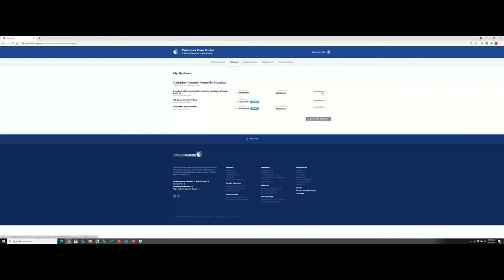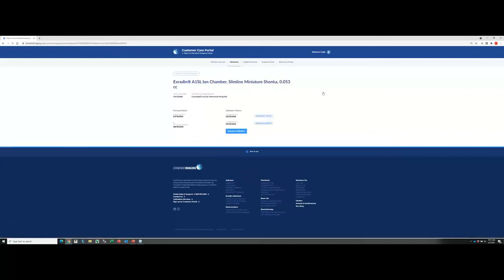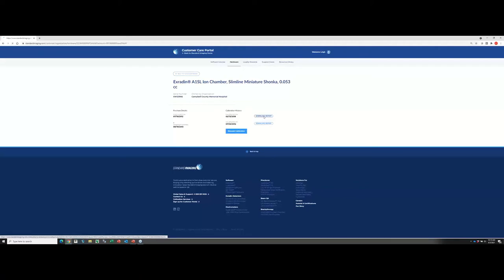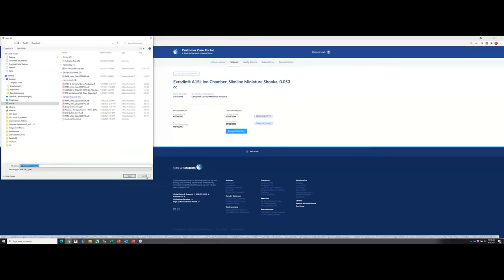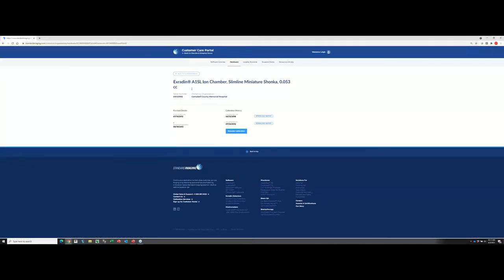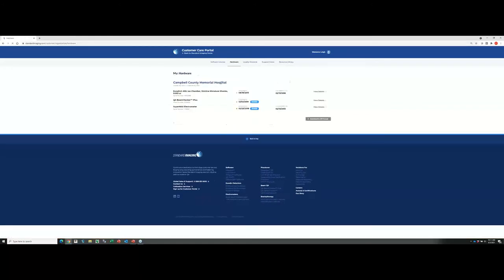I've switched browsers here just so that we can view this Campbell County Memorial Hospital. If I click on the view details button now, this actually gives me the option. It shows me whatever calibrations that we would have for this. In this particular case, this A1SL chamber, it would show me the different calibrations that we have on file. And then you can go ahead and click this download report, and you can download a copy of the calibration report. I'm not going to go ahead and do that. You get the idea of what you can do. I'm just going to hit this go back to hardware option here.